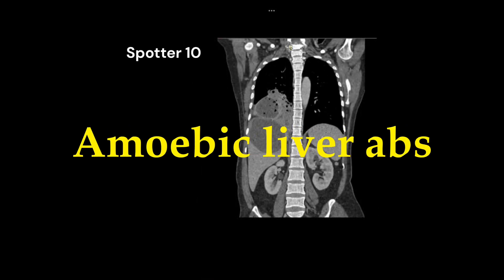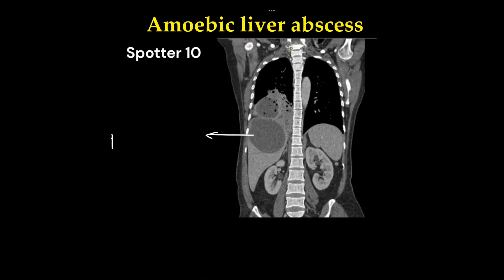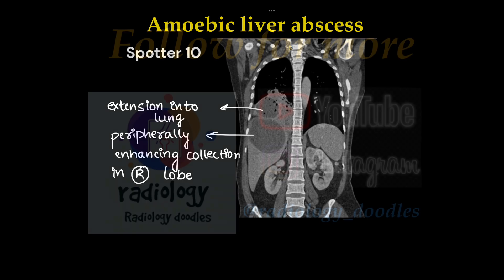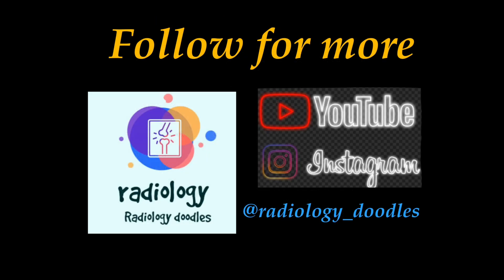This is a case of amoebic liver abscess. There is a peripherally enhancing collection or cystic lesion in the liver, indicating an abscess. The right lobe is more characteristic for amoebic abscess, and it can have extension to the lung, as seen in this case. For more such spotter videos, follow our page on YouTube and Instagram.